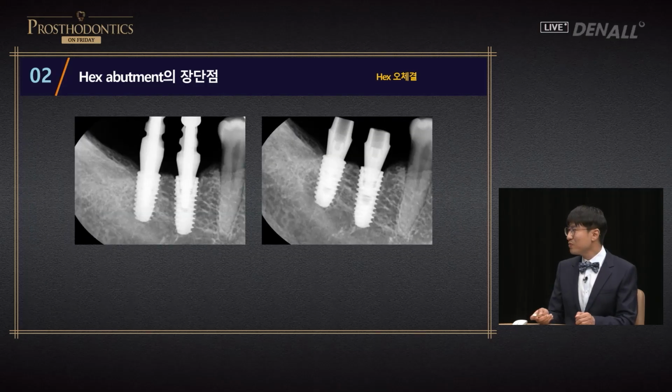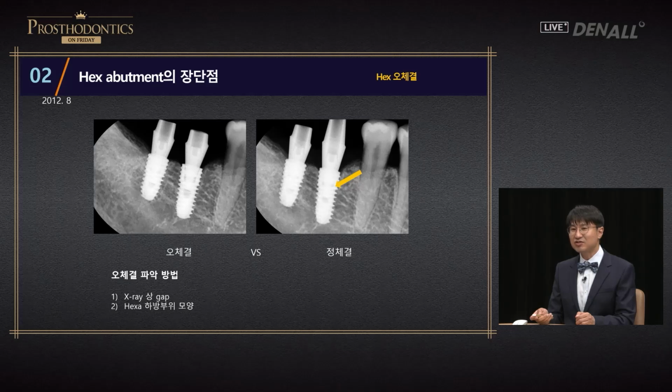This impression coping is from company D, and you can see there's interference and there's wrong connection. This was reflected in the transfer jig and the abutment. I found this problem quickly and I corrected it into corrected connection.